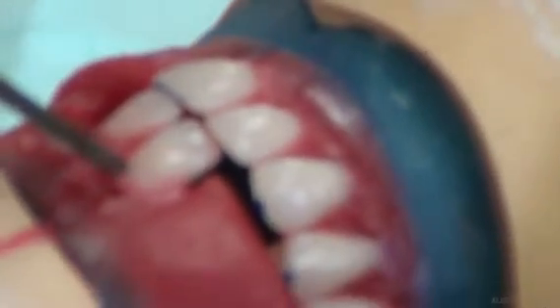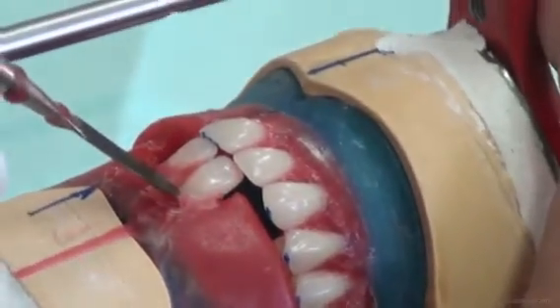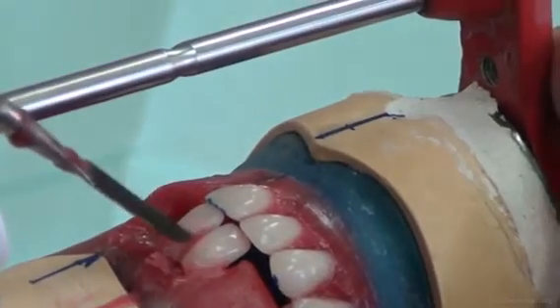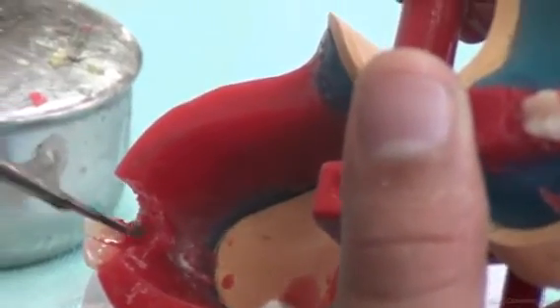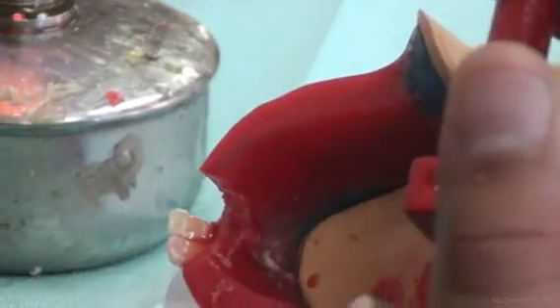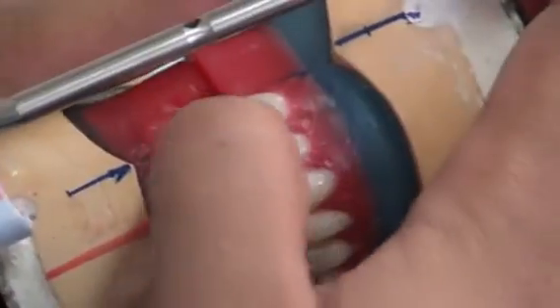This is how we move teeth in their location. We can adjust the position of the tooth, adjust the position of the root, and make sure that all inclinations are correct, and recheck them on the upper. We also fix the tooth from the lingual side, making sure that we have enough molten wax going around the tooth and around the interdental papilla area to fix it in place.